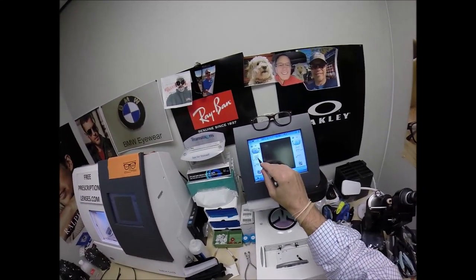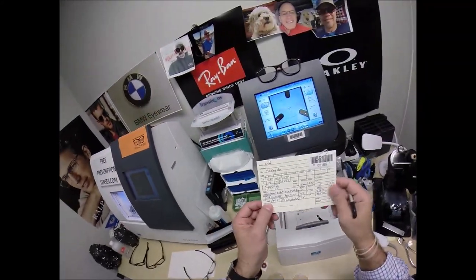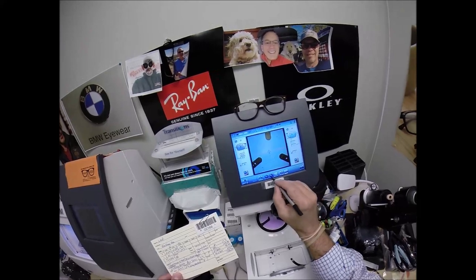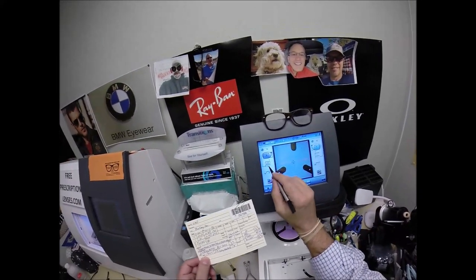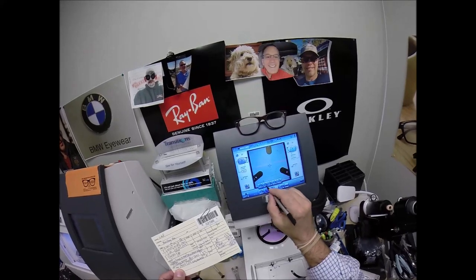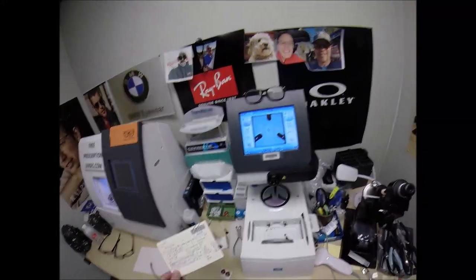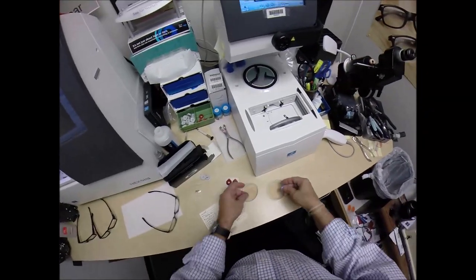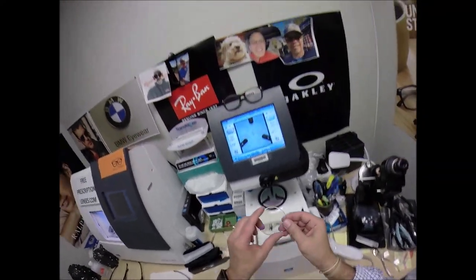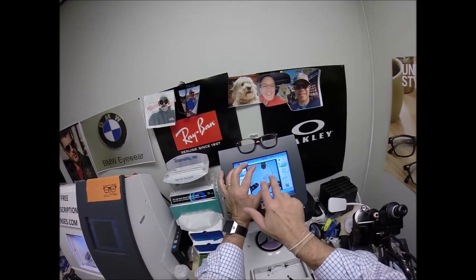I'm going to enter your pupillary distance and the optical center height. Your pupillary distance for the right eye is 34. The computer starts at 32.5, so I'm going to tap that plus button. Let's take the seg height, the position of wear, to 18, and change the layout screen from single vision to progressive. Now I've already dotted up your lenses. This tells me that it's oriented in there just perfectly. That's going to sit directly in front of your pupil.